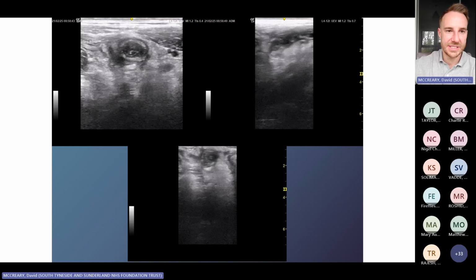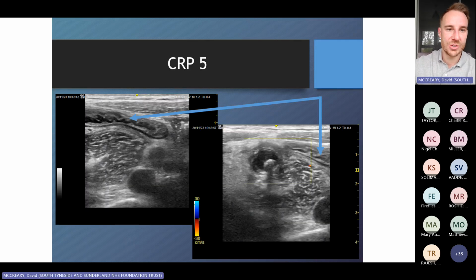Again, appendicitis. I think this was done by Bethany. Well done, Bethany. So really, really echogenic. And this was just a case of putting the probe on where it was sore, which for this child was quite low down from McBurney's, even lower than we'd expect, but it's appendicitis. Dead easy. So you're going to be bored of appendicitis soon.